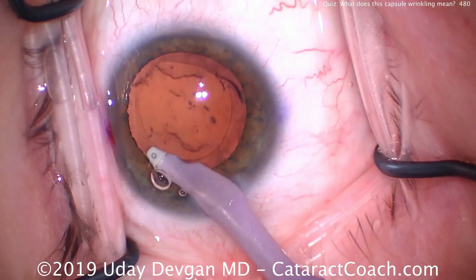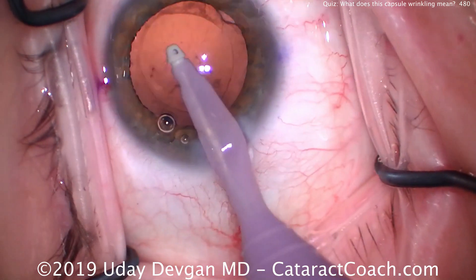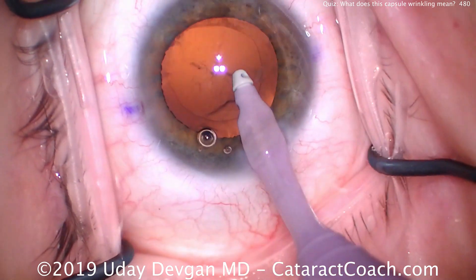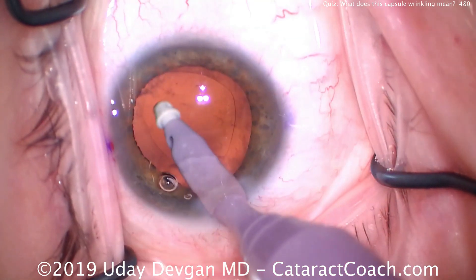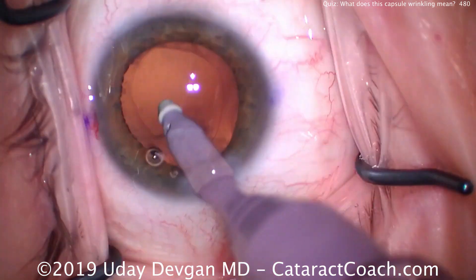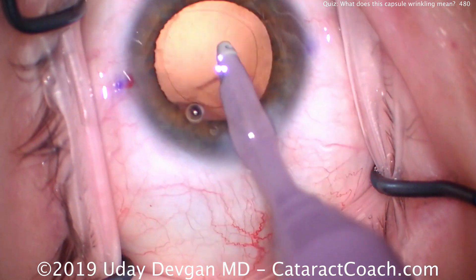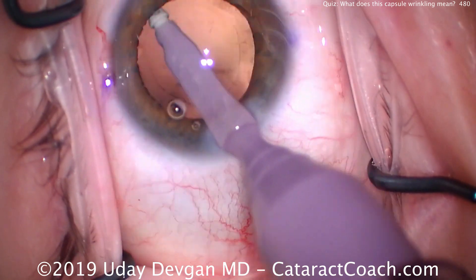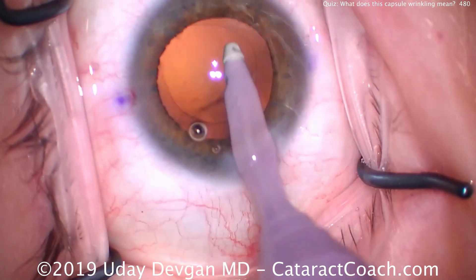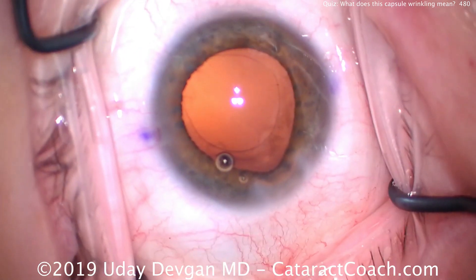What are the options for this surgery? We can put a single-piece or three-piece lens in the capsular bag. You can also use a capsular tension ring — placing one may help prevent some of that phimosis. Remember this is a progressive disease, not just in one sector, so the capsular tension ring will spread out the forces and may help counteract some of the phimosis, but it's not going to prevent the zonular apparatus from getting weaker with time.